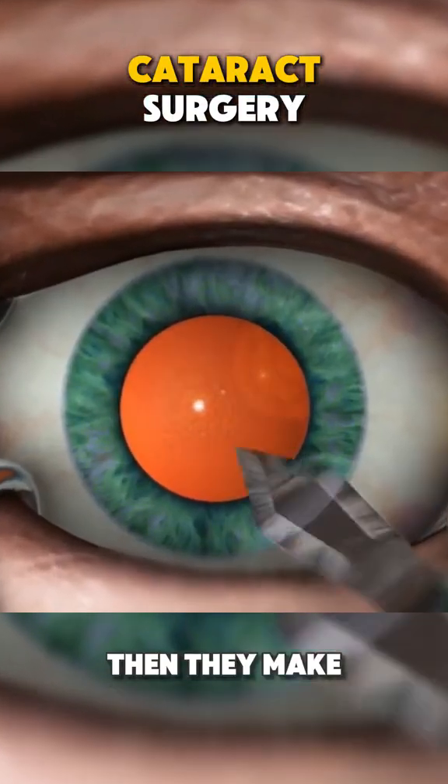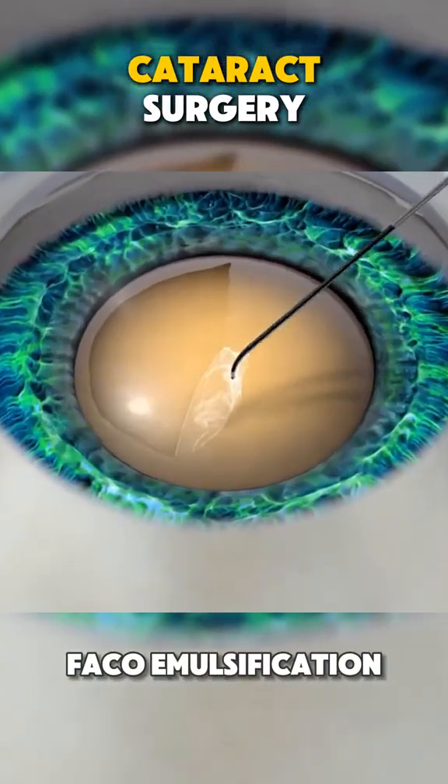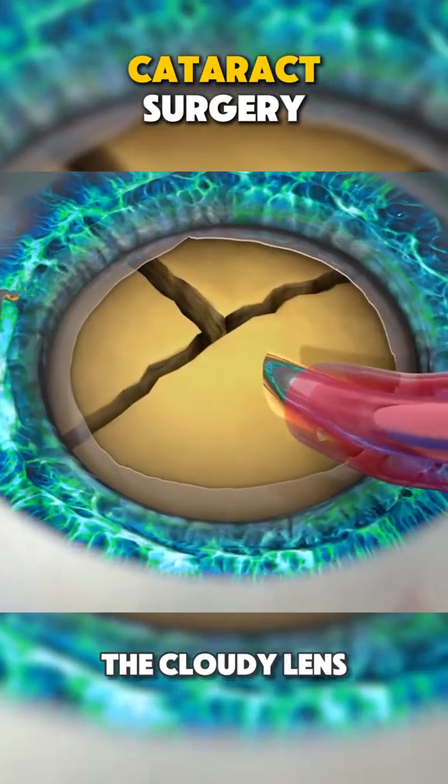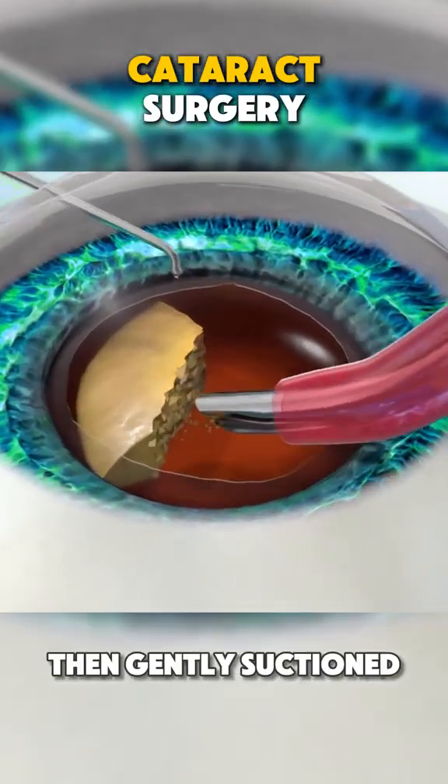Then, they make a tiny incision in the cornea. They use a special tool called phacoemulsification to break up the cloudy lens into tiny pieces. Those pieces are then gently suctioned out.